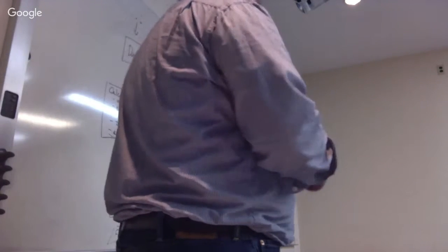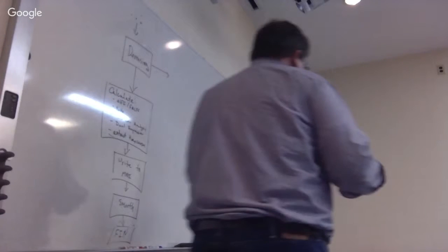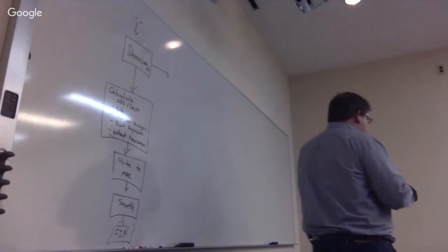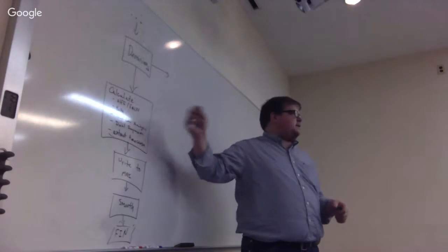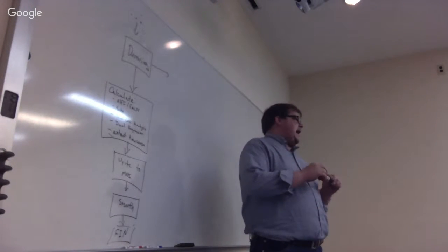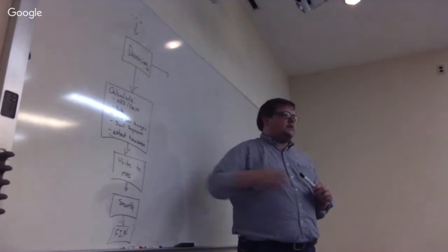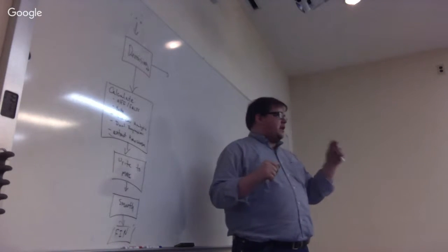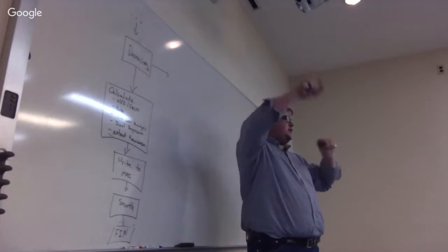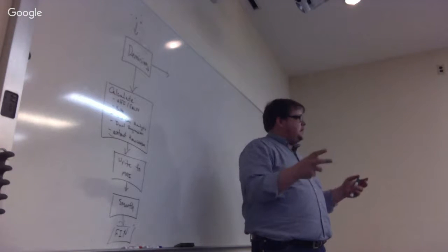Okay? So the reason why we do this is we want to reduce the amount of artifact that we introduce into the generation of these maps. Specifically, the biggest thing that happens is that all of the steps that are done, particularly these steps, increase the amount of spatial smoothness of the data. Right? So remember when I was talking about interpolation, when you average voxels together from nearby to create a new voxel value, that smooths the data, right?